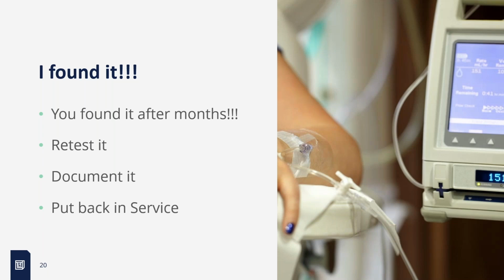If you're not documenting the retest after you repaired it, and that's even true if you found it and fixed it immediately and put it back into service, make sure you're documenting both tests on that piece of equipment.